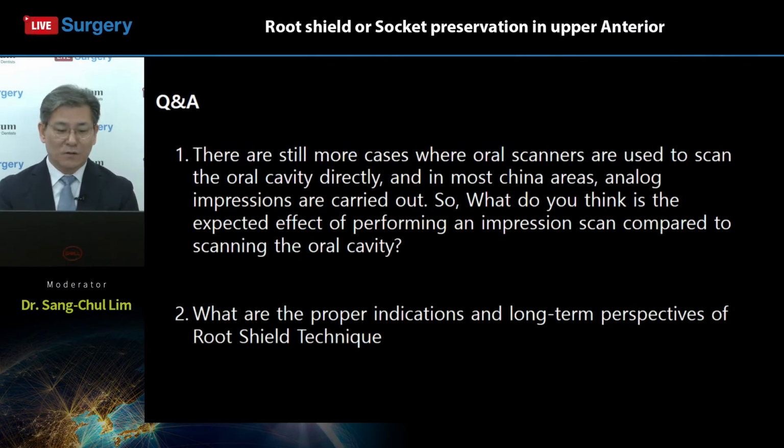First of all, I got 2 questions about today's surgery. Very excellent and good questions. Number 1, there are still more cases where oral scanners are used to scan the oral cavity directly, and in most China areas, analog impressions are carried out. So, what do you think about the expected effect of performing the impression scan compared to scanning the oral cavities?